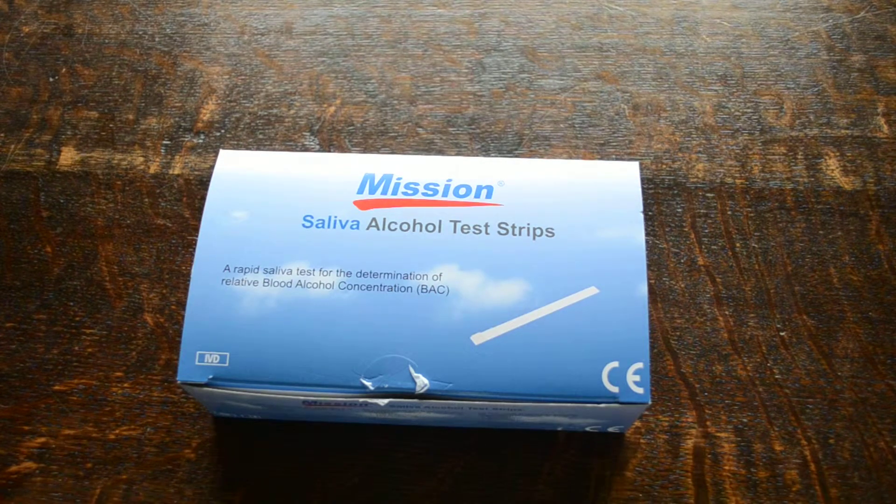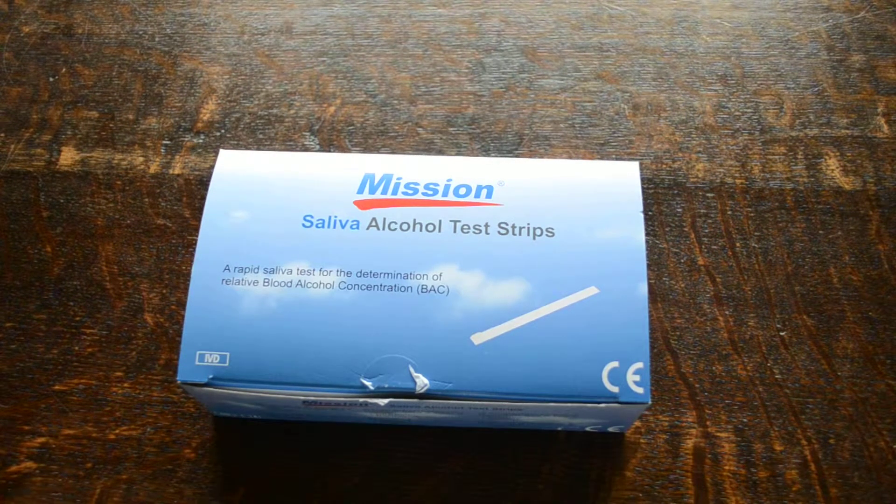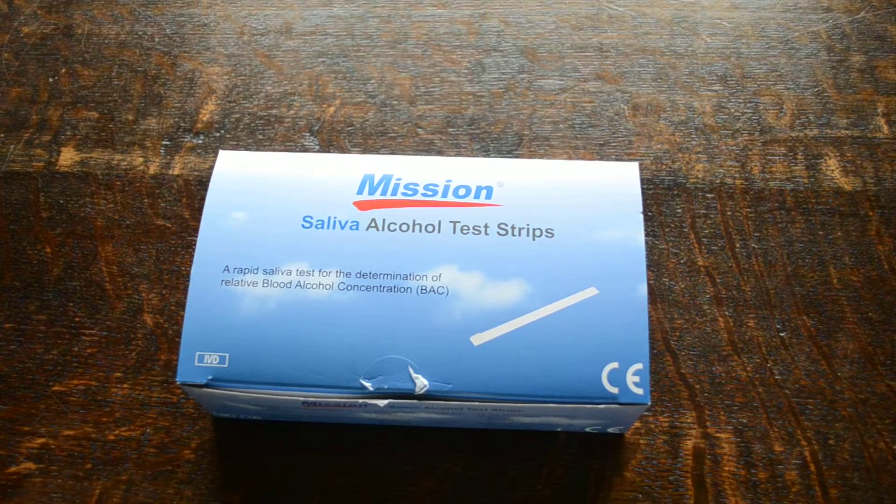This video presentation is to demonstrate the Mission Saliva Alcohol Test Strips. Mission manufacture these, and they are intended for use in saliva. They can be used in any liquid to detect the presence of alcohol, but these are a semi-quantitative detection tool if used in saliva.